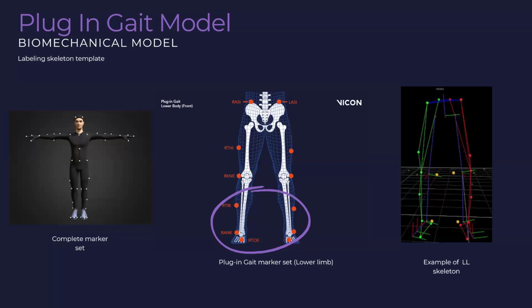I was thinking just starting the exo with the subject on the treadmill, and then starting the recording on Vicon, and then doing my trials as I'm doing with my instrumented insole. And use the timestamp of the Raspberry Pi and the Vicon and then synchronize everything together. But there is a delay, right?